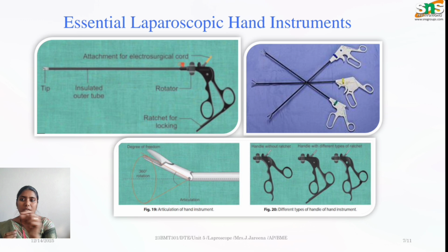We have a rigid type of flexible tube that is insulated by some sort of polymer, and at the tip you have a needle, so it will be easy to navigate. And also we have so many options with additional tools. As I said, if you want to take any type of biopsy samples, or you have to have a very good grip of that organ, we have graspers and clips and so on.